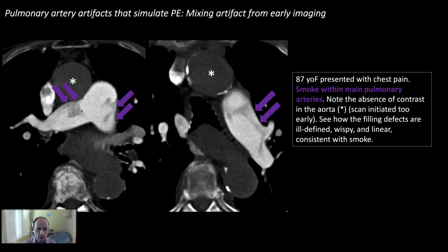Here is another example where there's mixing in the main pulmonary artery. This patient clearly has heart failure and pulmonary hypertension, so the pulmonary arteries are enlarged. There is no contrast in the aorta and we have wispy ill-defined filling defects in the main right and left pulmonary arteries — this is just mixing artifact, not pulmonary embolism.